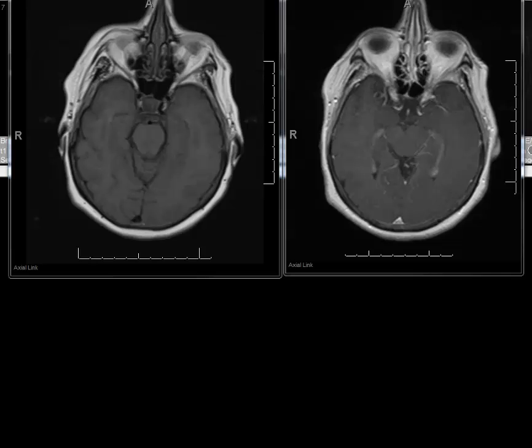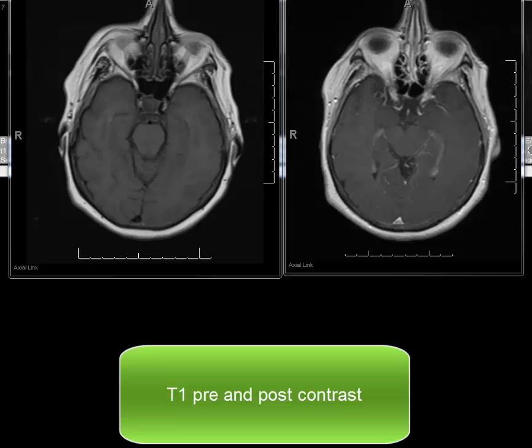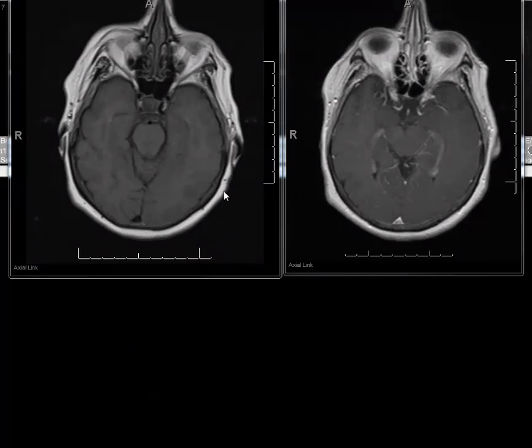The different pulse sequences have been developed that emphasize T1 and/or T2 relaxation times. Let's first look at the T1-weighted images. Here we have on your left a T1-weighted image without any contrast administration. This sequence is the most useful for analyzing anatomic detail.